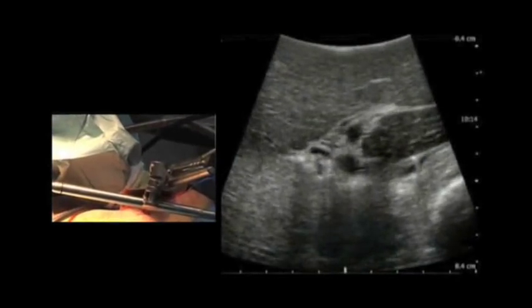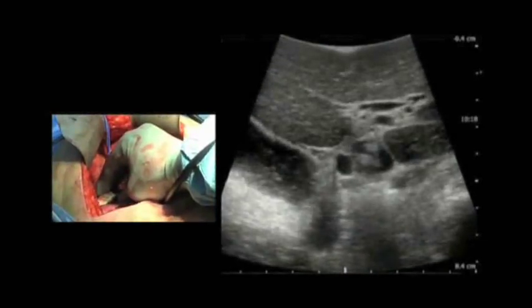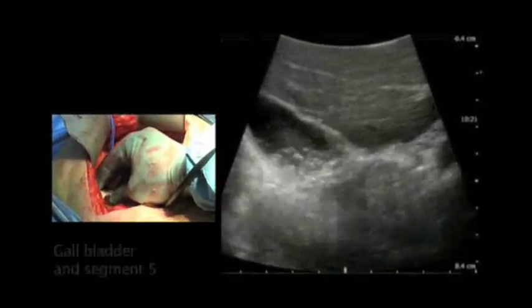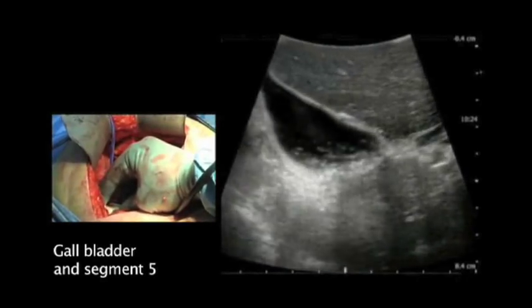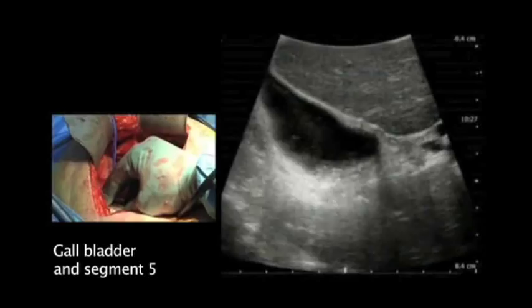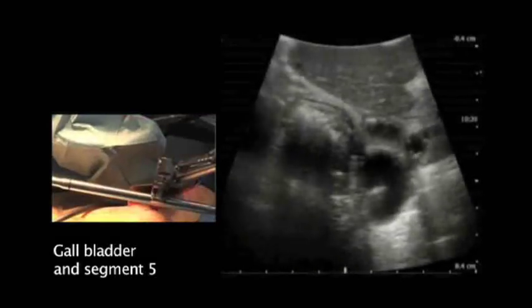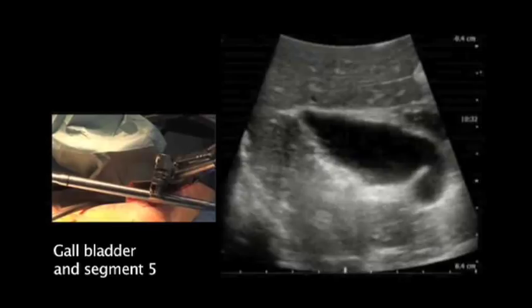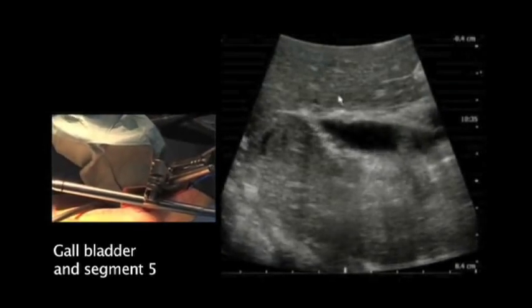When we go more downwards, we will pass the central structures as we are seeing here, and we will also be able to see the gallbladder, which is coming here in segment number four in front of it, and segment number five laterally to it.